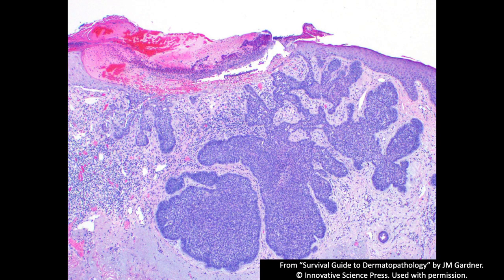Switching gears: not all that is basaloid is basal cell carcinoma. Just because it's basaloid and in the skin doesn't mean it's BCC. Here's a classic, obvious basal cell carcinoma — one of the first tumors learned in pathology. Blue nests of basaloid cells with nice peripheral palisading, a distinct fibrous and myxoid-looking stroma with inflammation, and sometimes clefting around the edge of the nest.